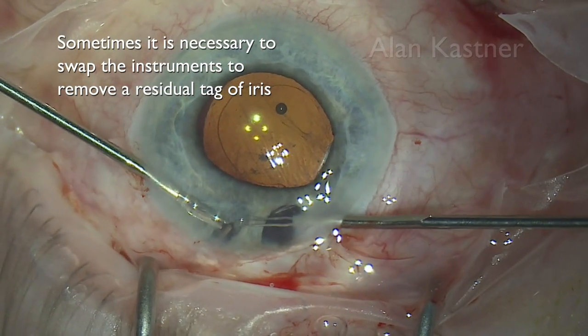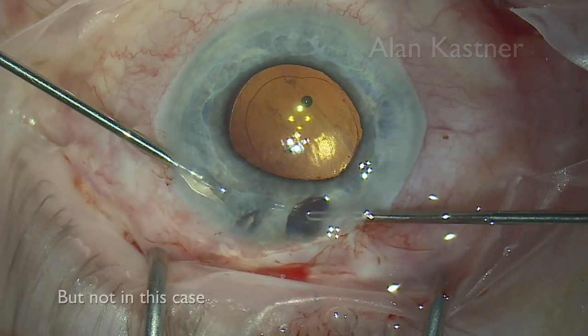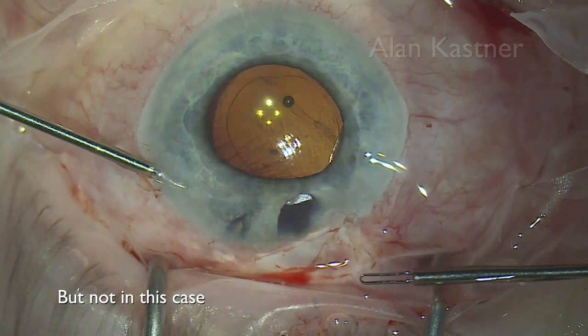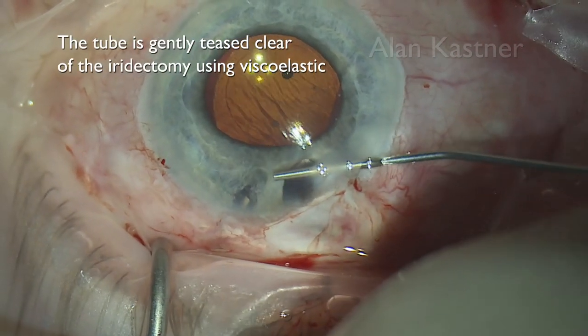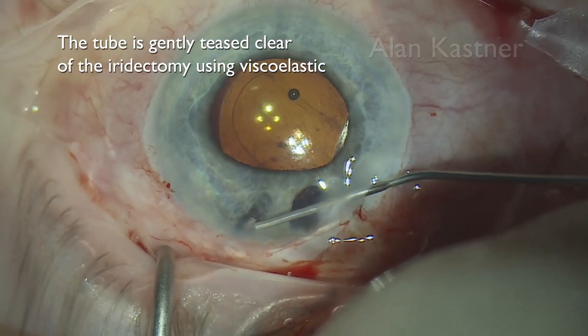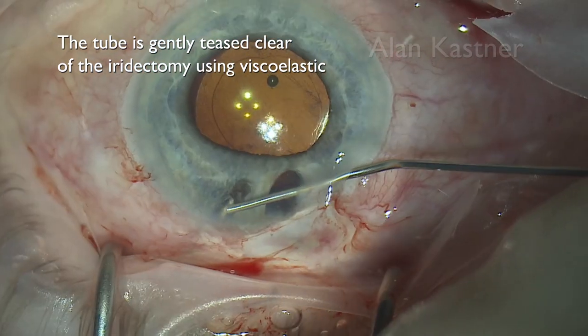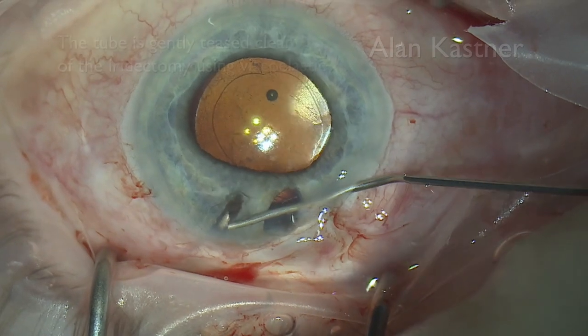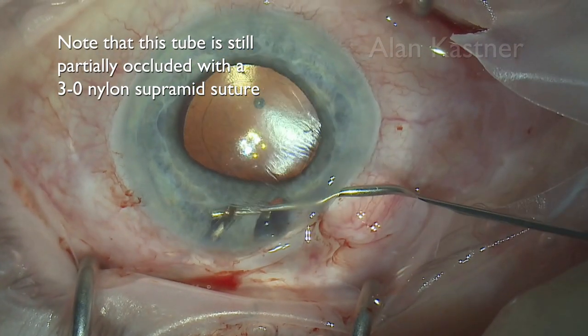Sometimes it's necessary to swap the instruments round to remove a residual tag of iris, but not in this particular case. The tube is gently teased clear of the iridectomy using viscoelastic. Note that this tube is still partially occluded with a 3-0 nylon supramid suture.